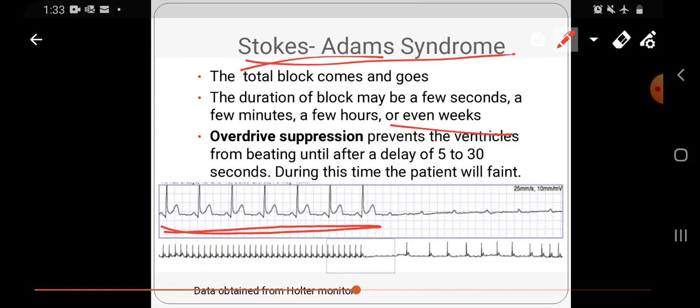بعدين suddenly the block will happen. وبالتالي رح نشوف إنه ال ECG strip بس فيه P waves. There are no QRS complexes. طبعا during this time لما يكون عنا بس P waves هذا بيعني إنه ال ventricles they are not contracting. Okay, there's no pumping of blood.